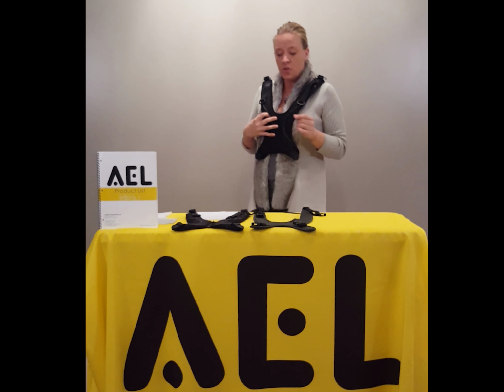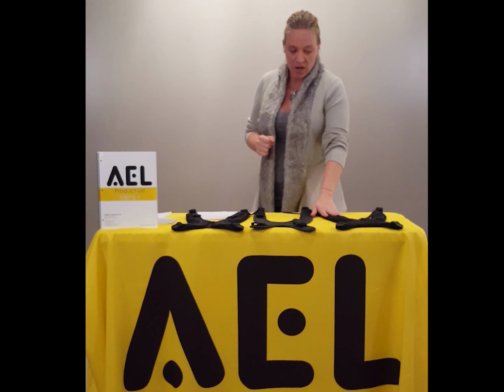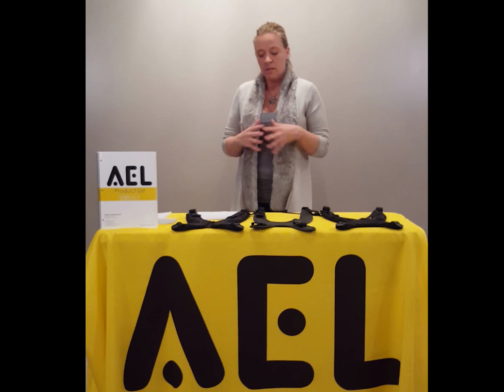This is also nice for clients who present with the risk of pressure-related issues or skin breakdown as a result of the support cutting in or becoming wrinkled or uncomfortable. With the stretch option, because of the full engulfment capability, we also see a reduction in the amount of cut-in or discomfort associated with its use. So that's a plus. Another thing you may find is a little bit of improvement in patient satisfaction. Because it is more of a stretch option, many clients will report that it is a more comfortable option to wear.